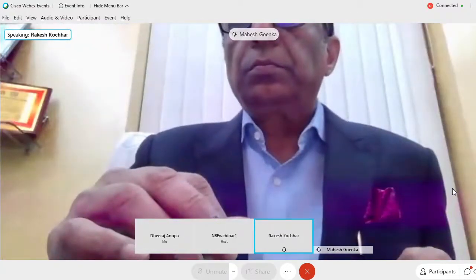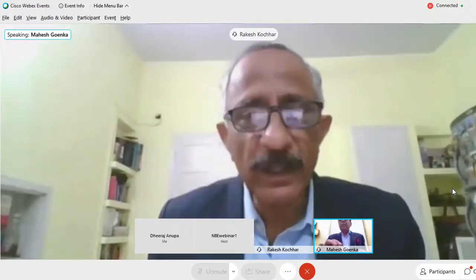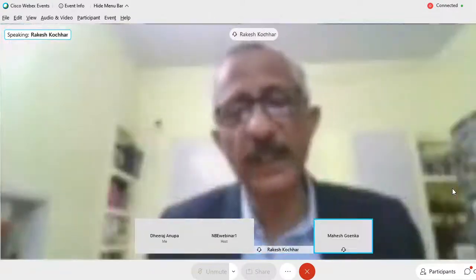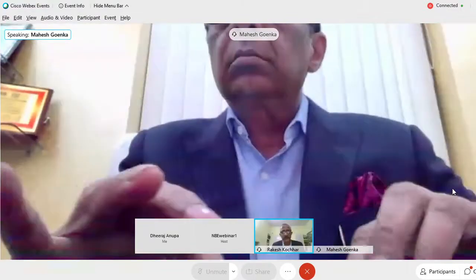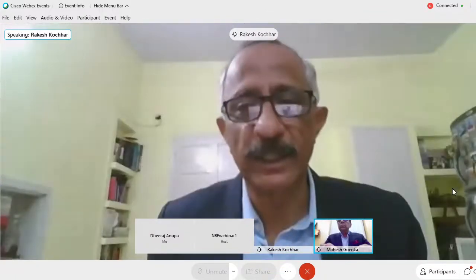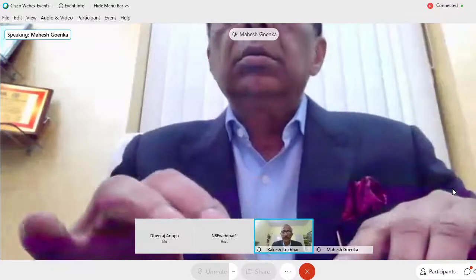With or without esophagitis. You also said that retroversion can also help us in the differential diagnosis. Yes, retroversion will show you the laxity of the diaphragmatic crux. So that is a part of the examination of the hiatus hernia. Can we differentiate D2 and D3 endoscopically?